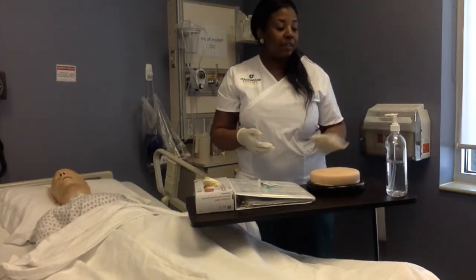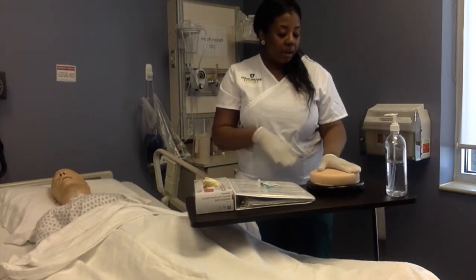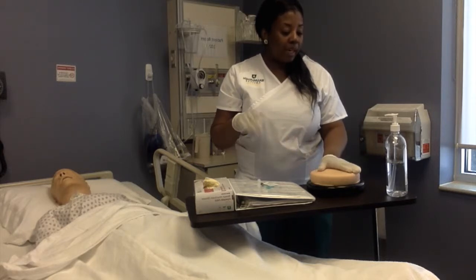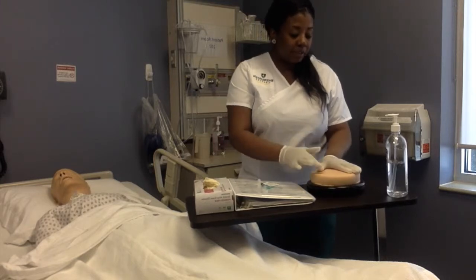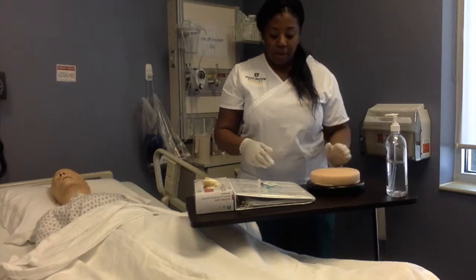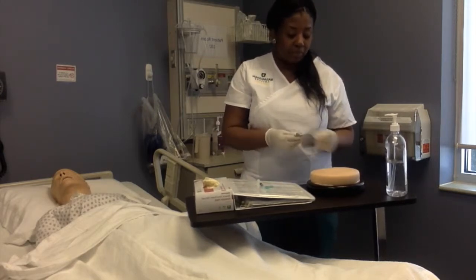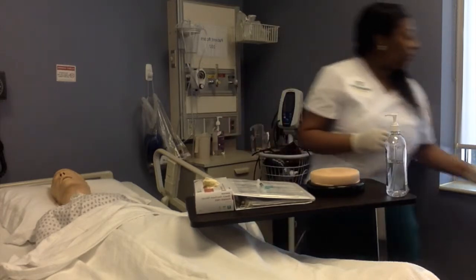So because it is in the ventral gluteal, I need to locate my iliac crest, my greater trochanter of the femur bone, and my anterior superior iliac spine. Right there, right in the middle where my hand is, is where I will give the injection. Before I do it, I want to prep the skin with the alcohol pad and let it air dry.